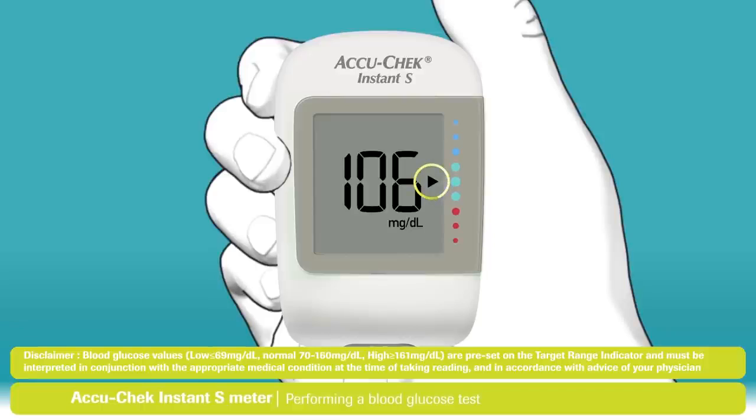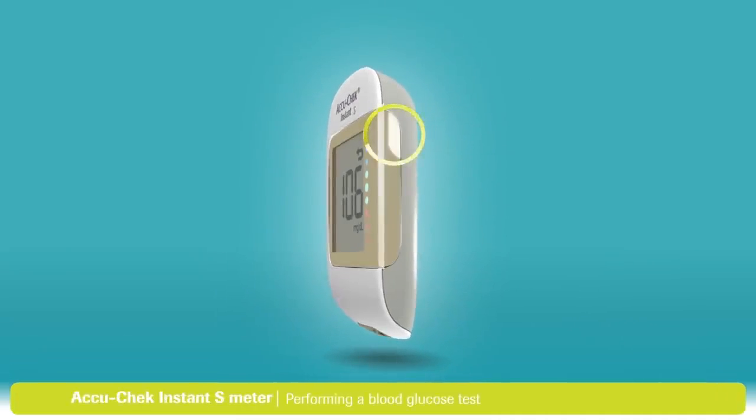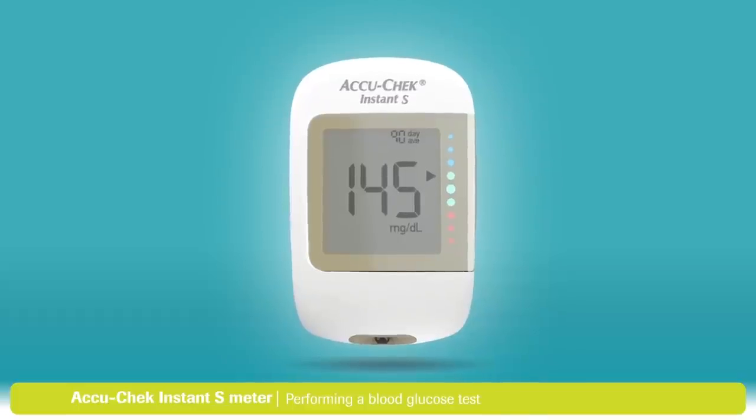The target range is represented by the green region of the target range indicator. The arrow will flash if your result falls above or below this range. The target range can be individualized to meet your personal therapy goals. If you press the button, you can view your previous 7, 30, and 90 day averages on your display.